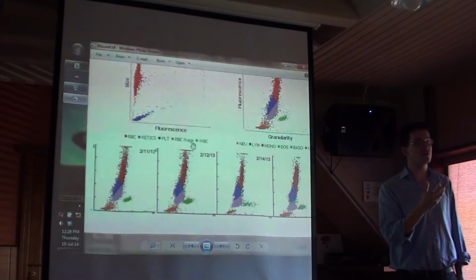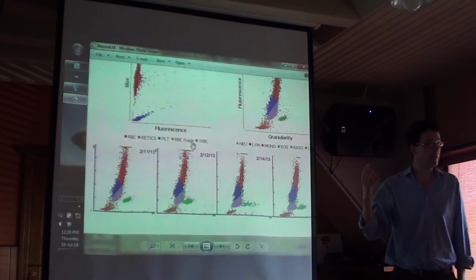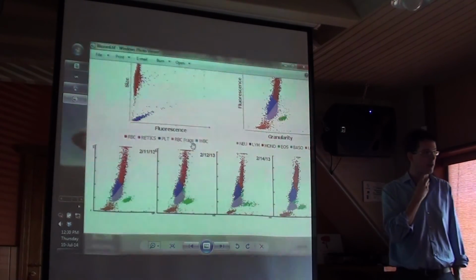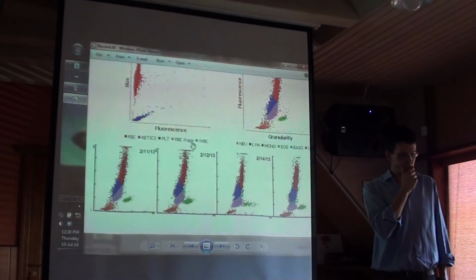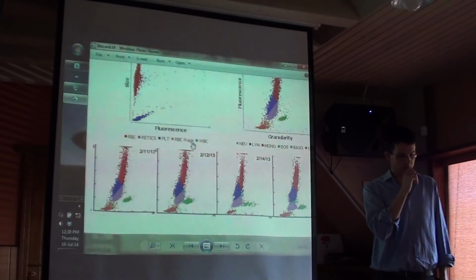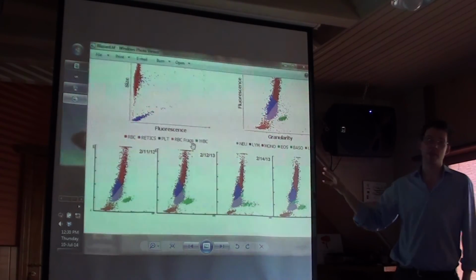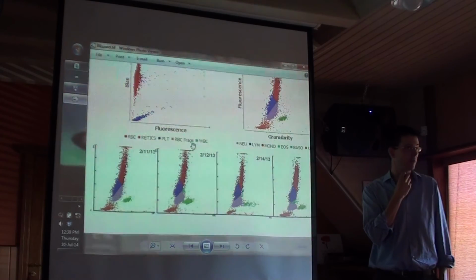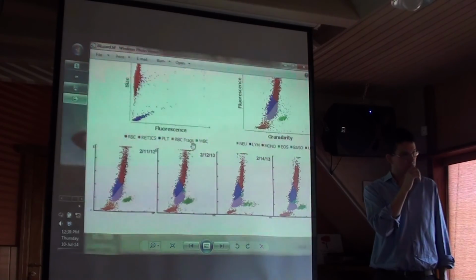So it's challenging to meet a new subject when there's apparently a lot of complexity. However, you very quickly learn when looking at these graphical reports that they become familiar and you quickly spot the abnormalities. Hopefully you've appreciated that all hematology analyzers have these sort of graphics, but how much information you can get from them.